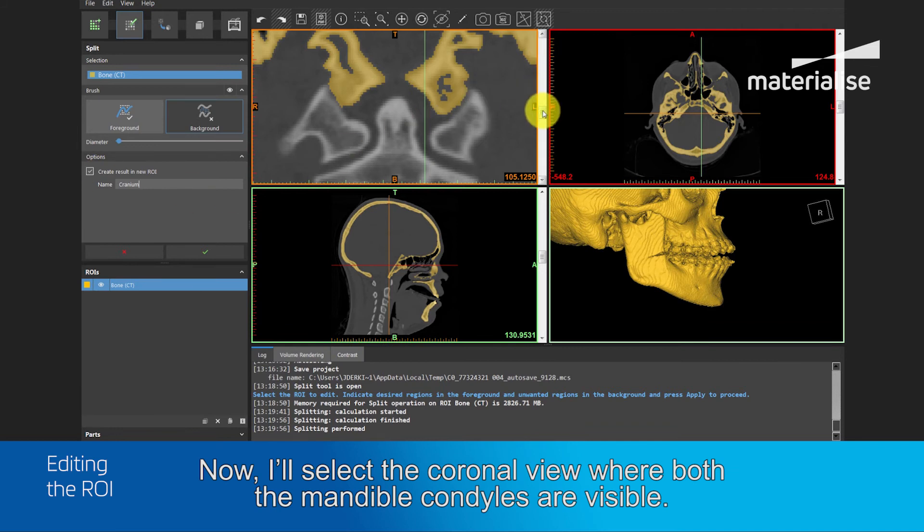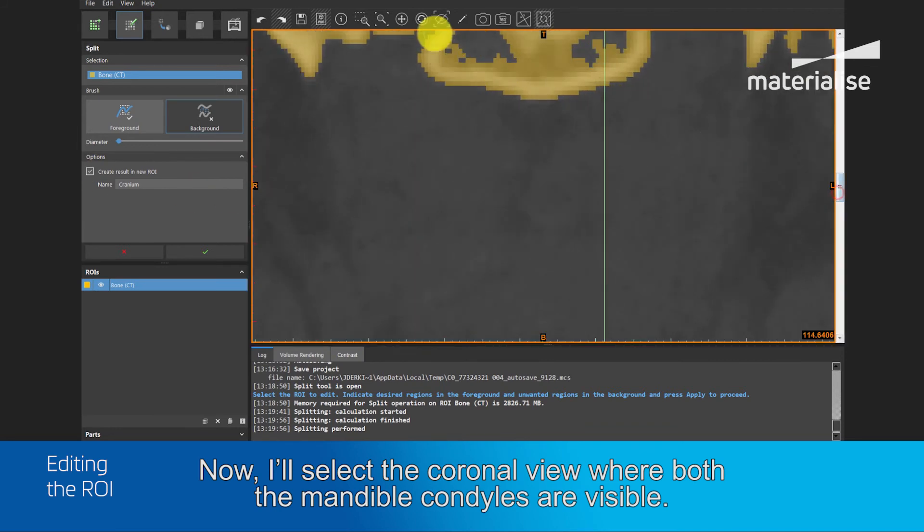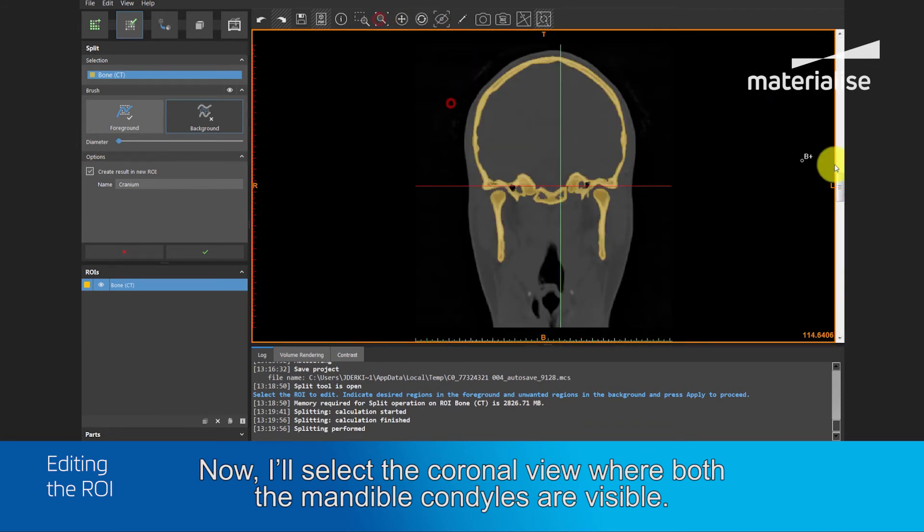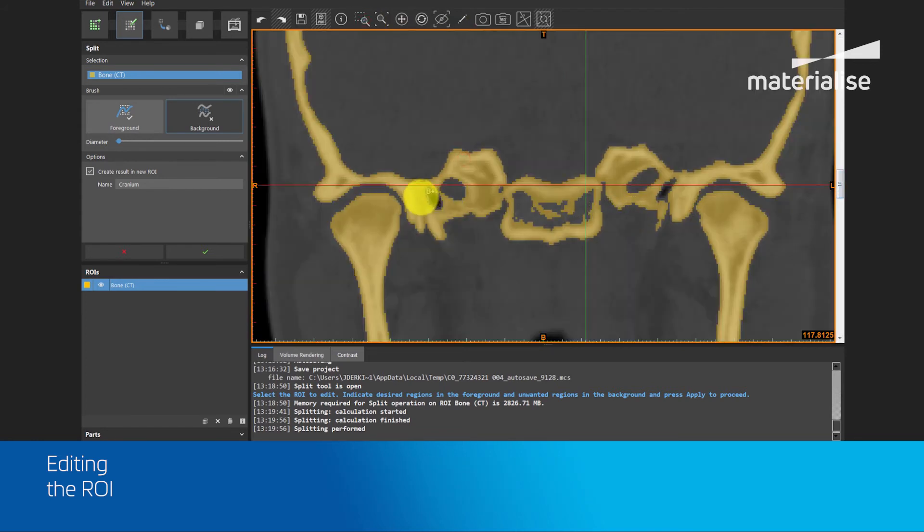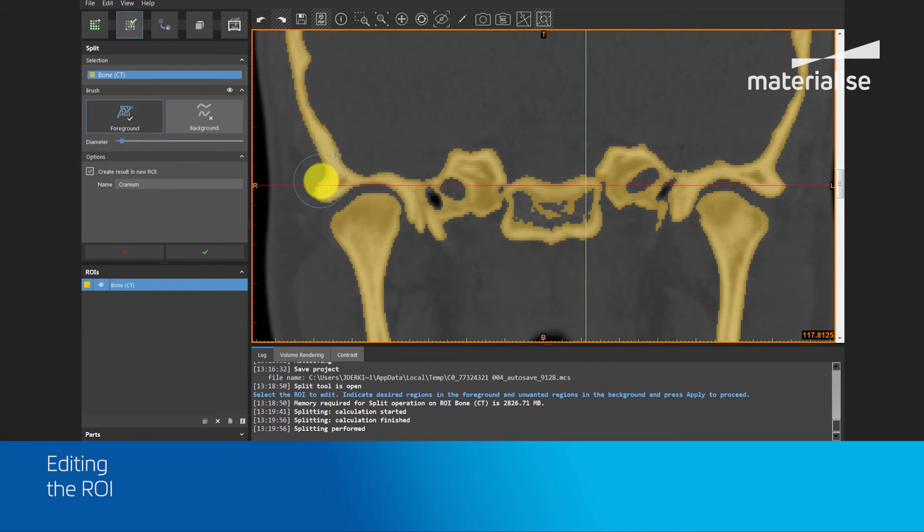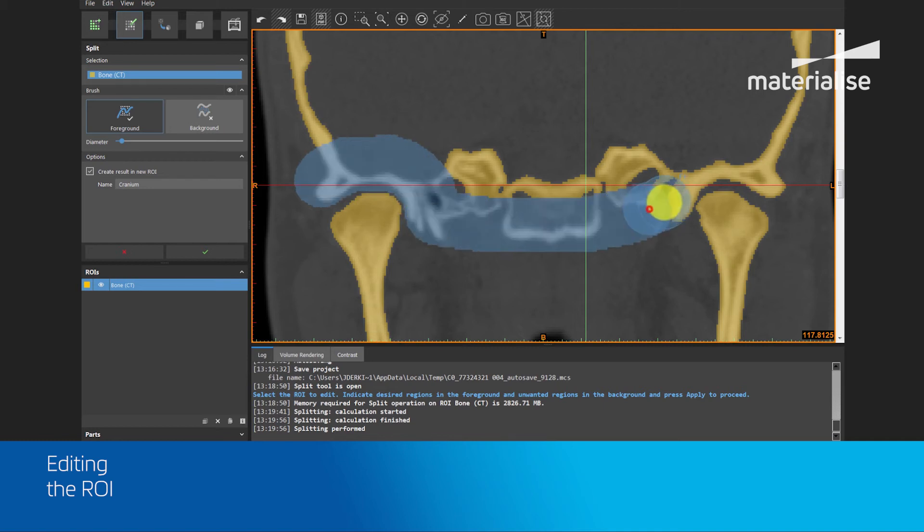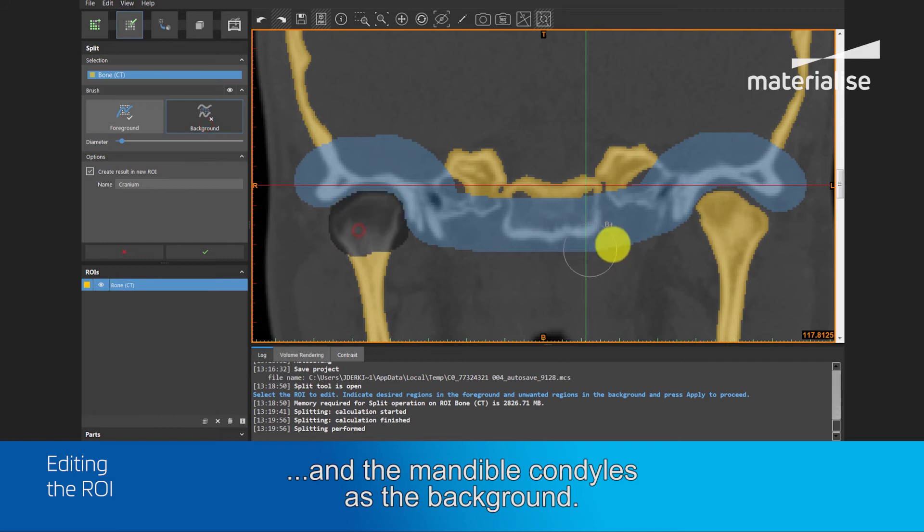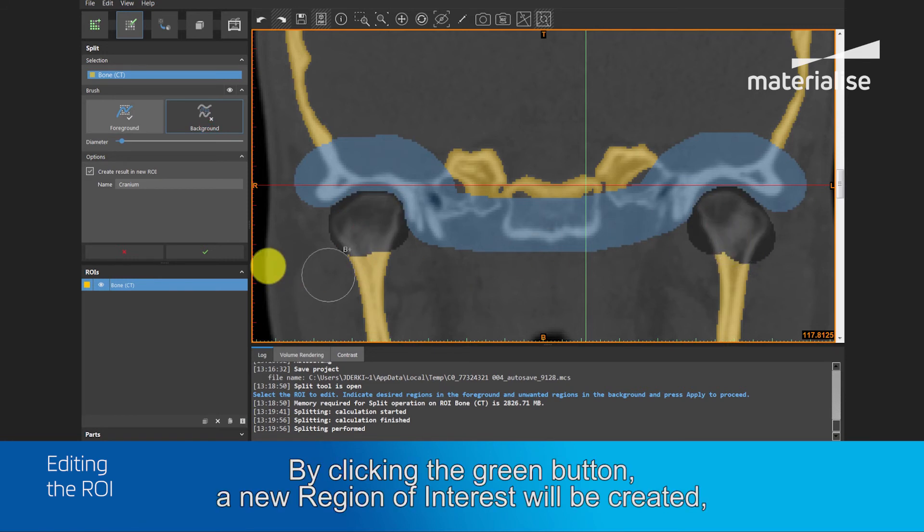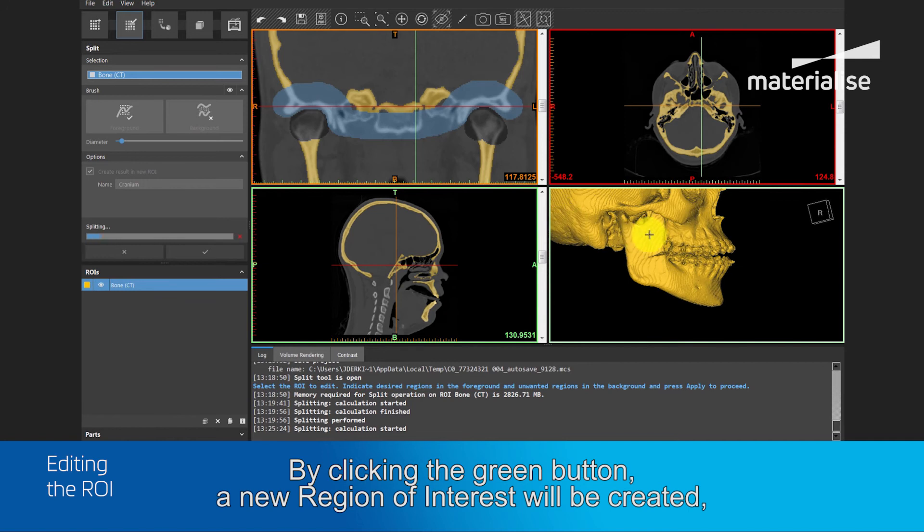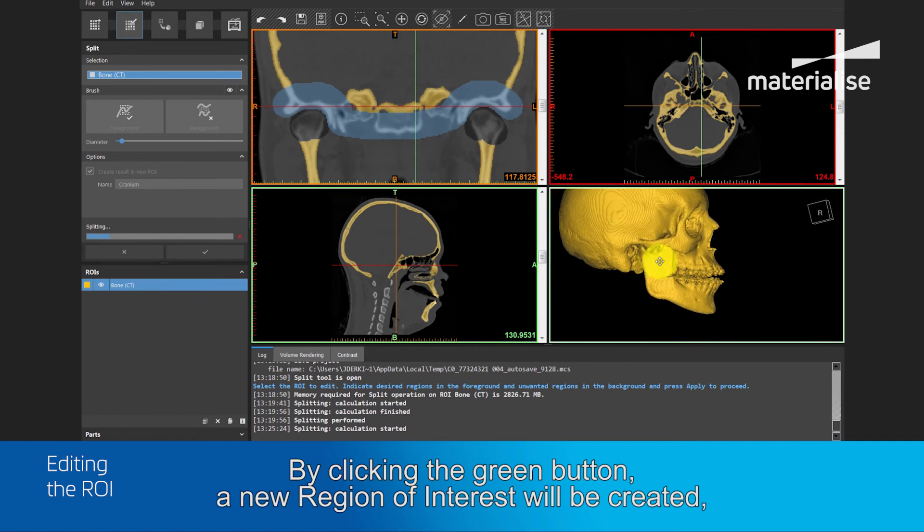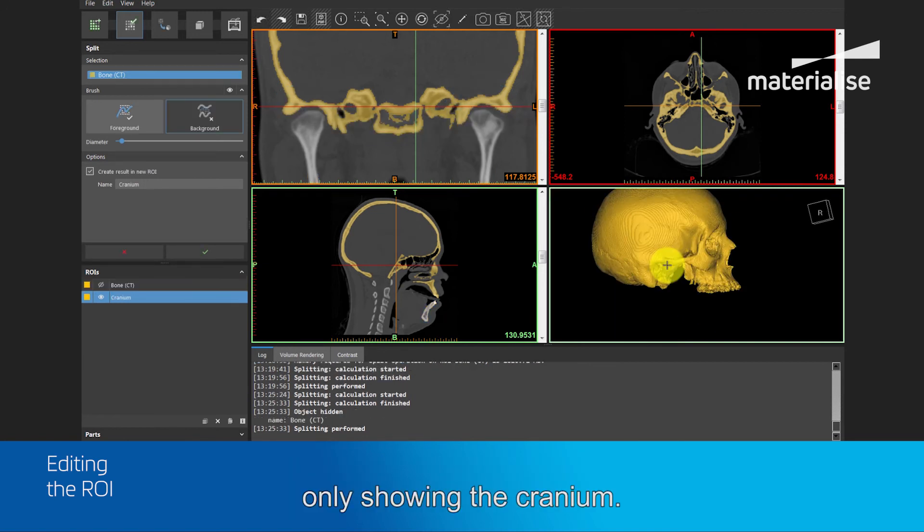Now I will select the coronal view where both the mandible condyles are visible, and I will carefully select the cranium parts as the foreground and the mandible condyles as the background. By clicking the green button, a new region of interest will be created only showing the cranium.